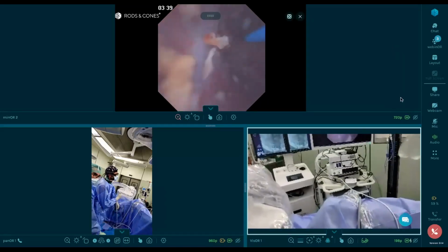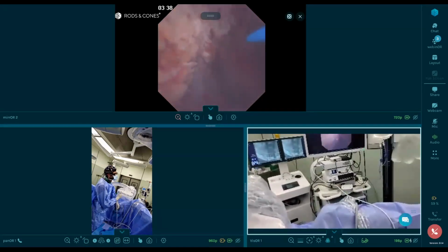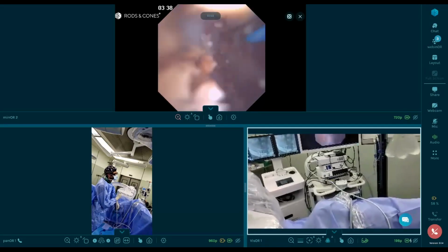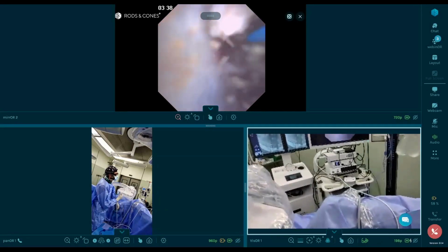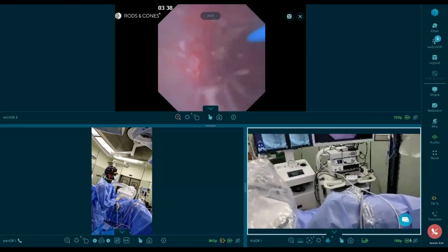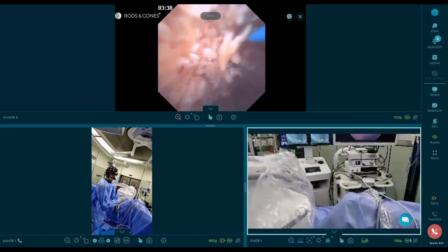We're almost done here. I'm going to stop. Don't break any more. So for the last bit of the popcorning, what I like is just to have gravity irrigation, nothing more. I don't want a manual pump because I don't want the fragments to go away from the tip of my fiber. Remember that popcorning is not done by the stones hitting themselves, but by the stone hitting the tip of the fiber. So you always need to have the stones very close to the fiber.